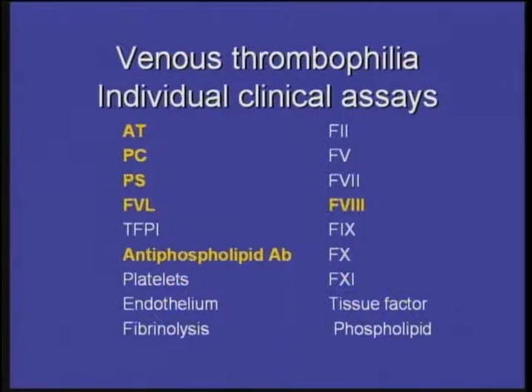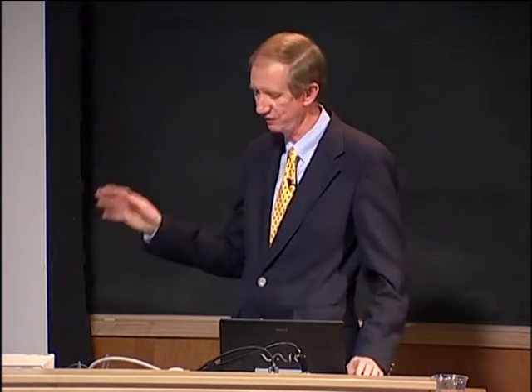Tissue factor pathway inhibitor, the other factor levels. We sort of look at factor II. We're looking at it to see if you have the prothrombin mutation, and that predicts higher levels of factor II. So you could say, in a sense, that we would also potentially evaluate that one. But we don't have any way of sort of looking at them overall. We don't have a PT or a PTT for the thrombotic side of things. What we have are individual assays that we do, and each assay predicts a certain degree of risk associated with it, but we don't really have an overall way of evaluating things.